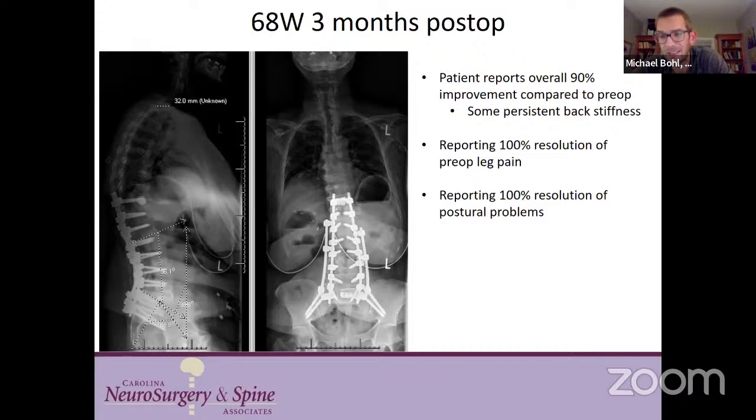And you can get a lot, especially with this kind of harms cage, you can create a lot of big anterior support from a single stage open posterior. I'll have to go into the anatomy lab and practice that, because I'm very much a posterior person. Also, we agree in many philosophical arenas, but right now I can't. I fished out XLIF cages from the back without damaging nerves, but right now I can't conceive snaking that around.